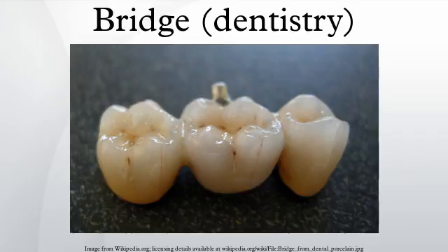Restoration fabrication. As with single-unit crowns, bridges may be fabricated using the lost wax technique if the restoration is to be either a multiple-unit FGC or PFM. Another fabrication technique is to use CAD/CAM software to machine the bridge. As mentioned above, there are special considerations when preparing for a multiple-unit restoration in that the relationship between the 2 or more abutments must be maintained in the restoration. That is, there must be proper parallelism for the bridge to seat properly on the margins.